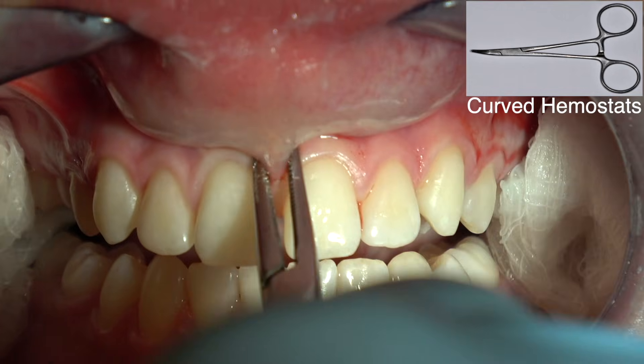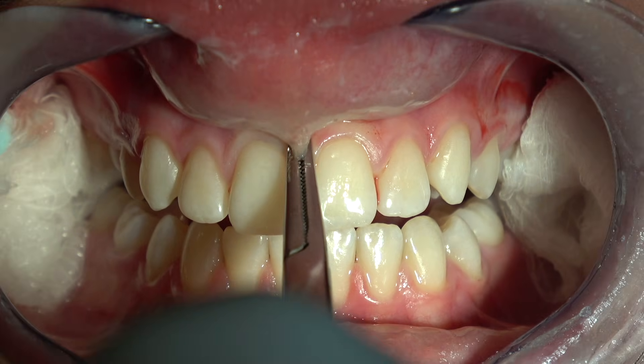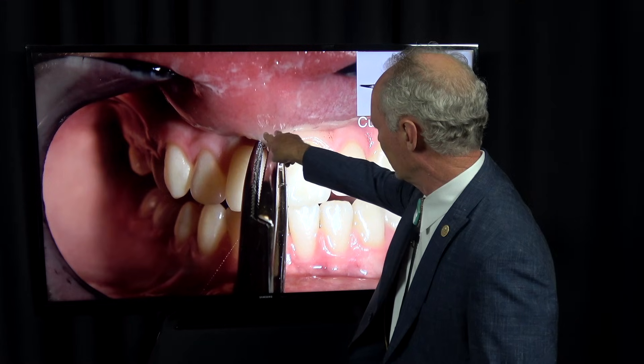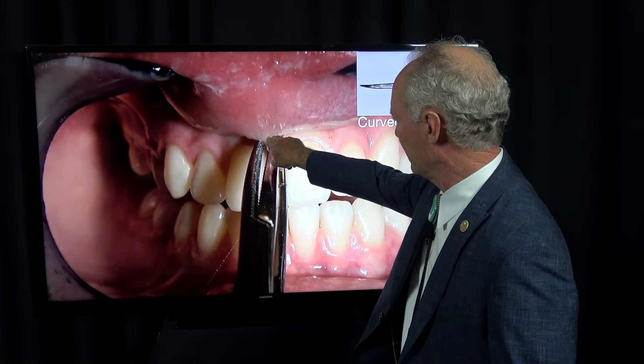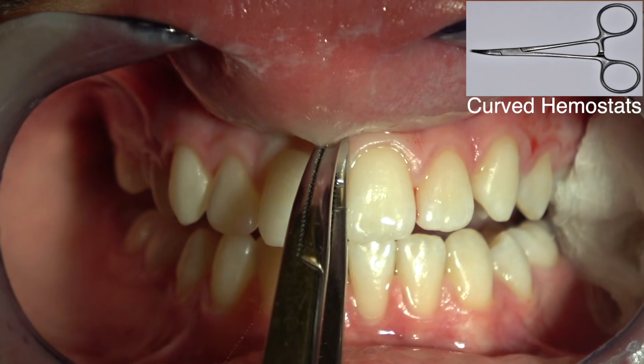These are curved hemostats. You place one on the lower part of the frenum like this, then connect the second one on the upper part of the frenum like this, and the tips of the hemostats touch each other.